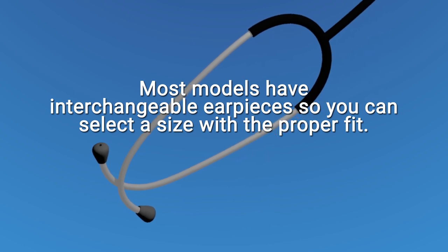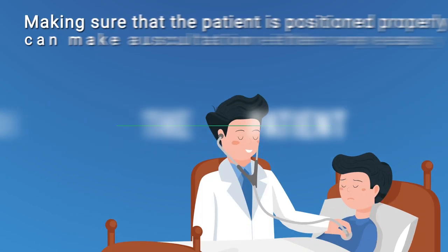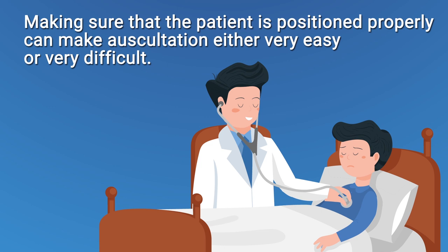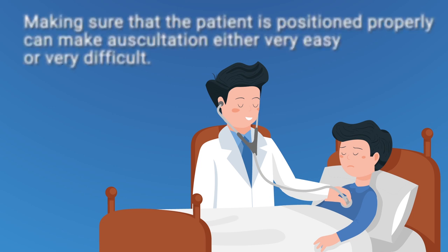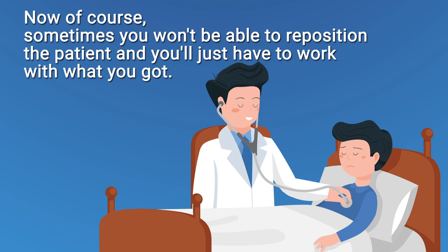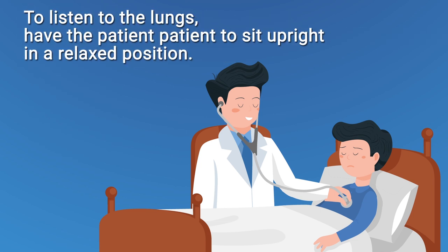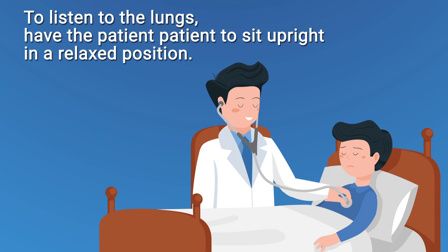The next step is to position the patient. Positioning the patient properly can make auscultation either very easy or very difficult. You won't always be able to reposition patients, so you'll have to work with what you have, but if possible try to position them in a way that makes listening easier. For example, to listen to the lungs, have the patient sit upright in a relaxed position.